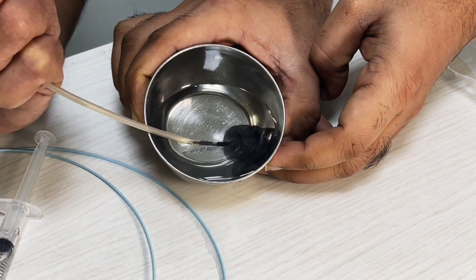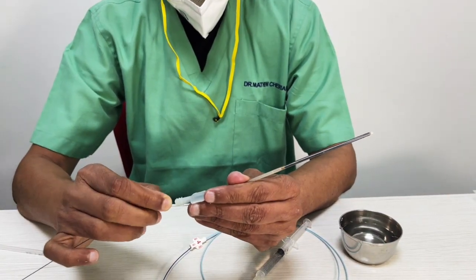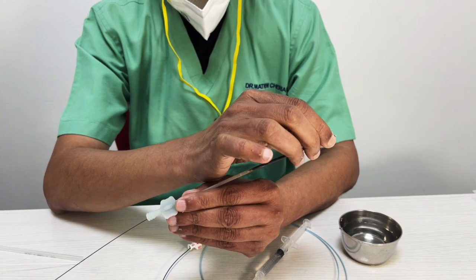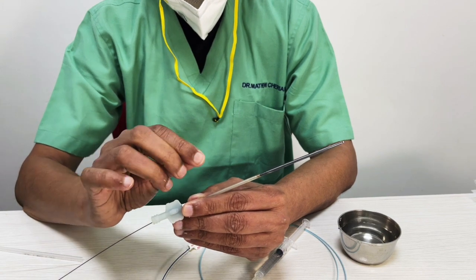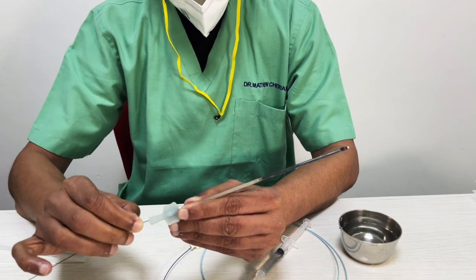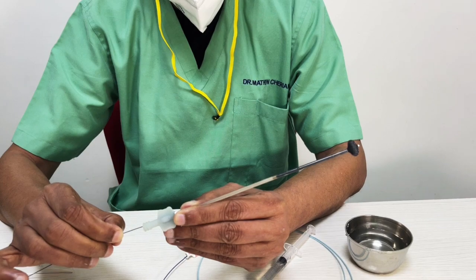Okay. So it's going to deliver the same way inside the body. We're talking about this, so let's have a look at it. In real life, how does it look? As you exit, remember this, it's very important that when you push this inside through the Y connector, somebody should be assisting you, or the Y connector should be really tight, so that this point is able to enter into the catheter. Because after this point, if this is slightly proximal, this is going to balloon out and it will never enter, right?